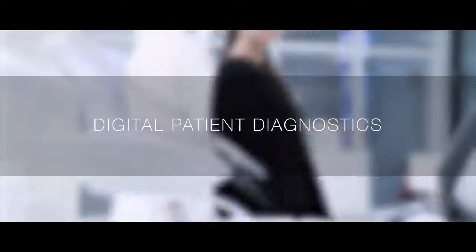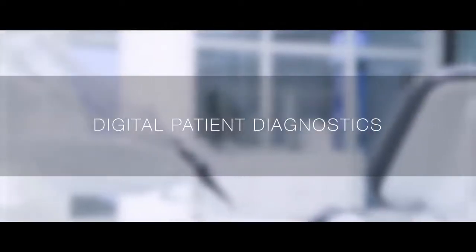Welcome to the Clinic de Medici by Zirkonzahn, our new education center, where dentists and dental technicians can learn our digital workflow by treating real patient cases.